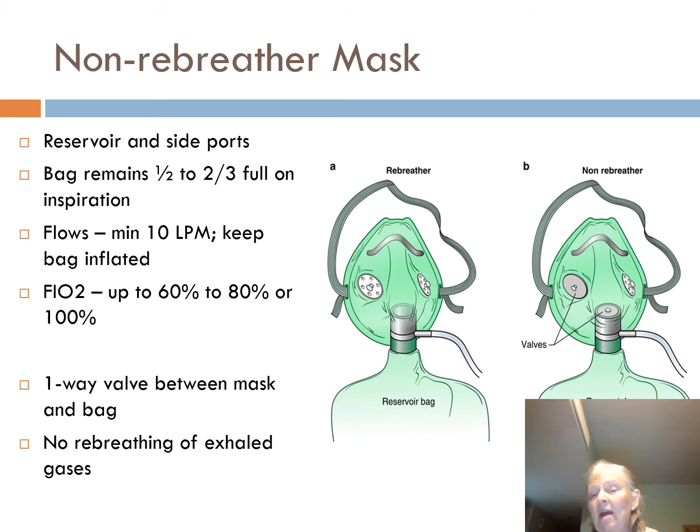Also, the fit of the mask. If your mask isn't sitting very tightly on your patient's face, they're entraining outside air, and if they're entraining outside air, they're diluting that so-called 100%, okay? So just remember with these, the major difference between a partial and non-rebreather is this little bitty one-way valve right here.